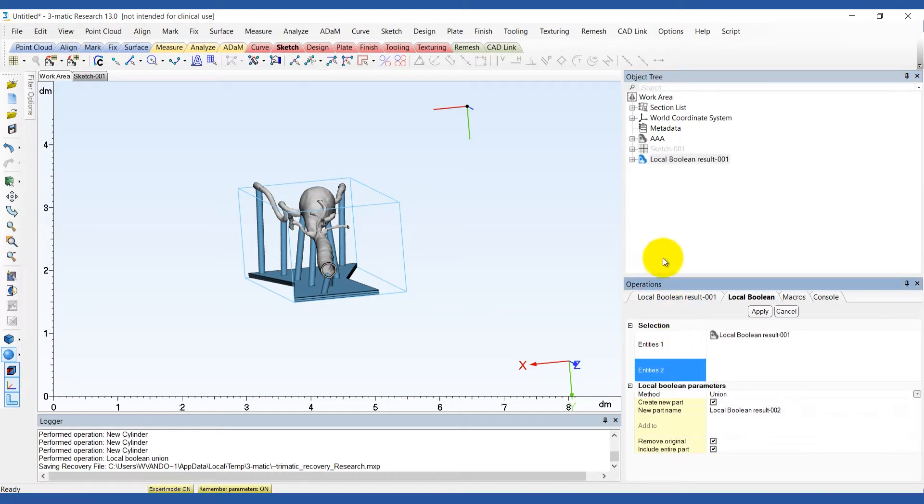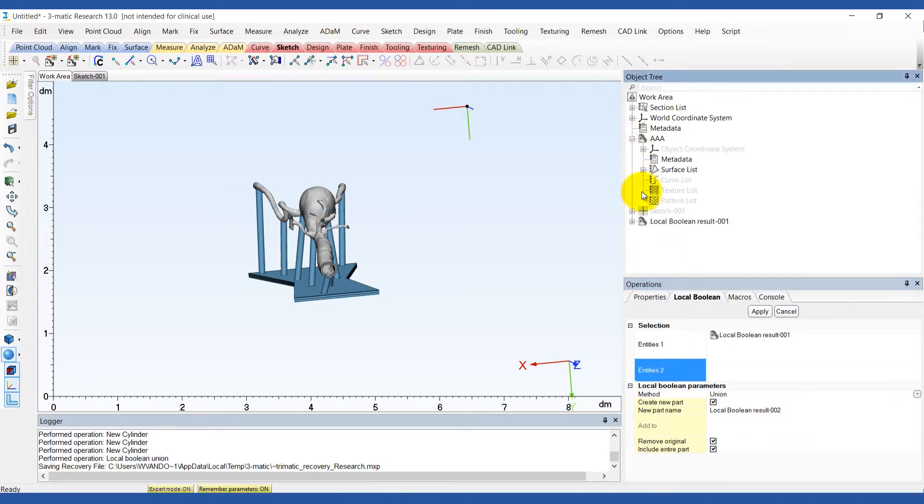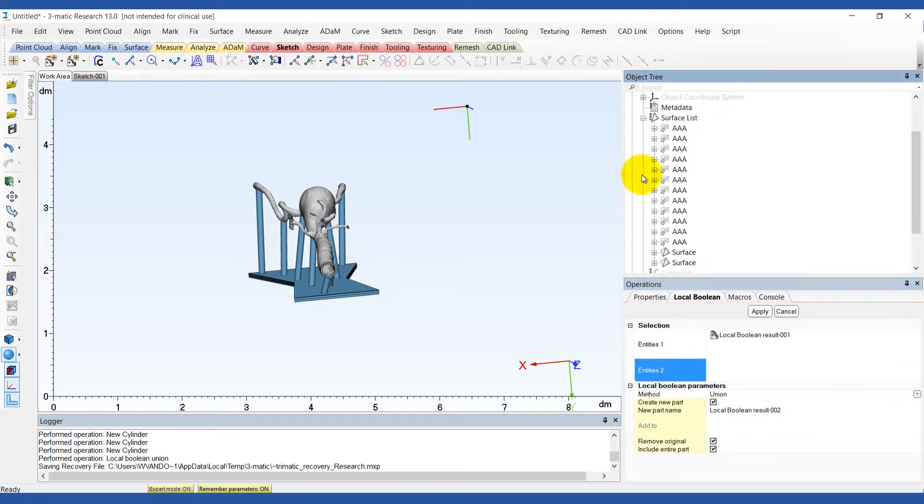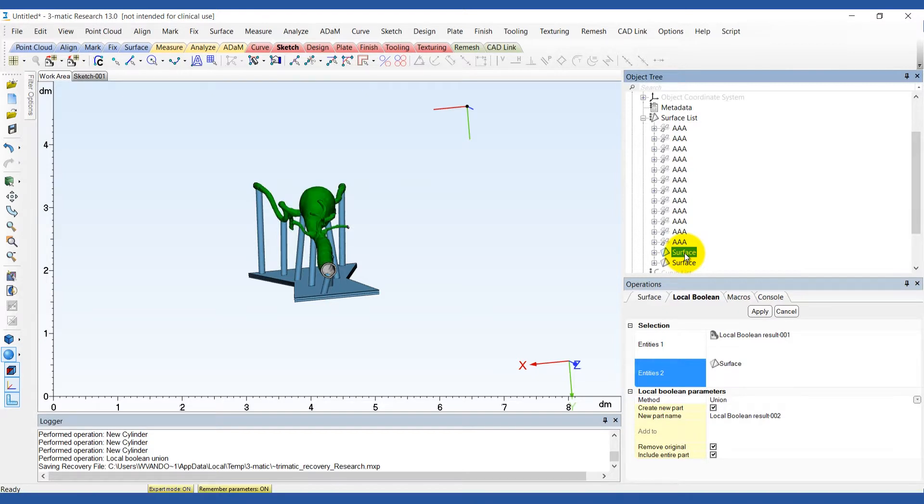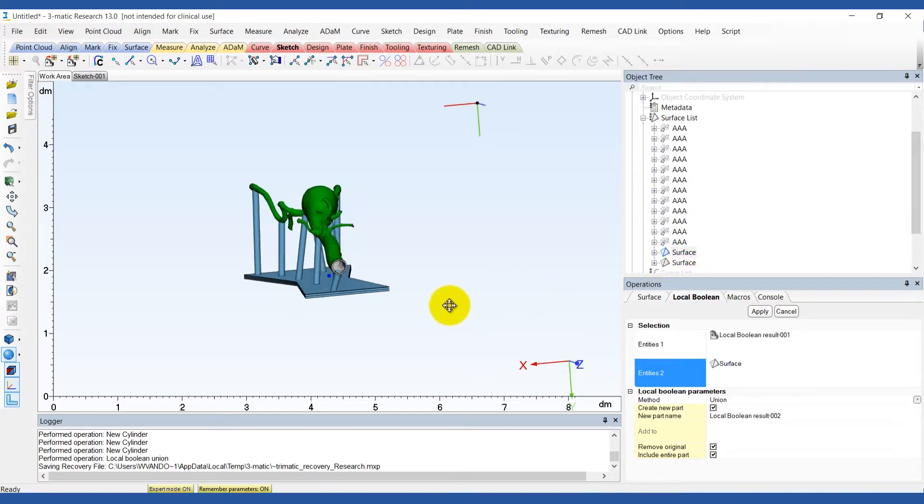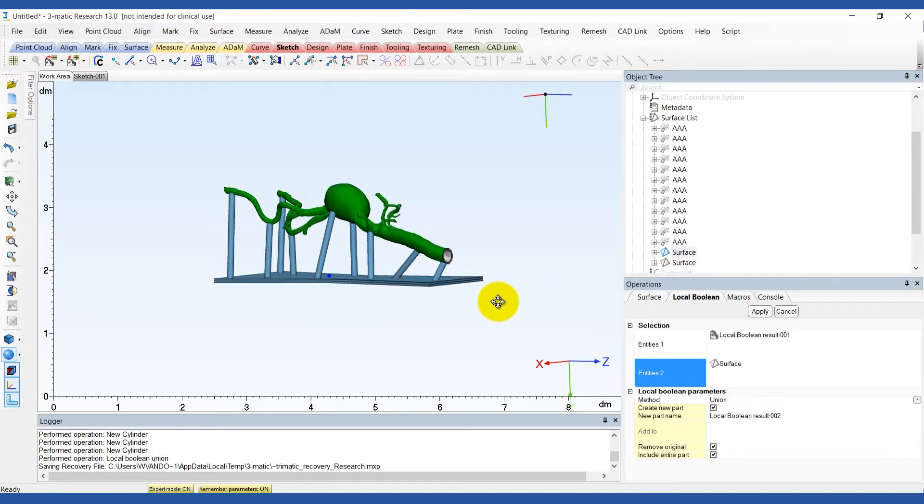With a second local boolean operation, we join the resulting supports and the outer surface of the AAA model. It's very important to select the outer surface.